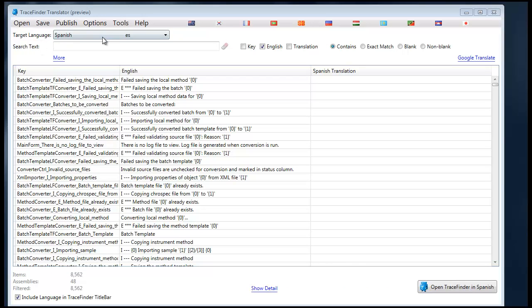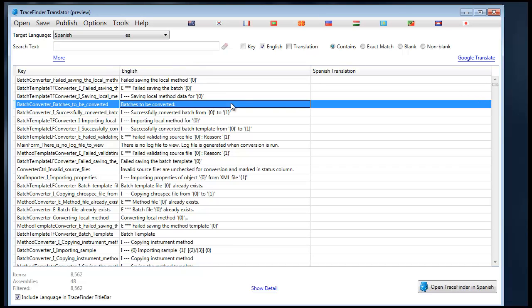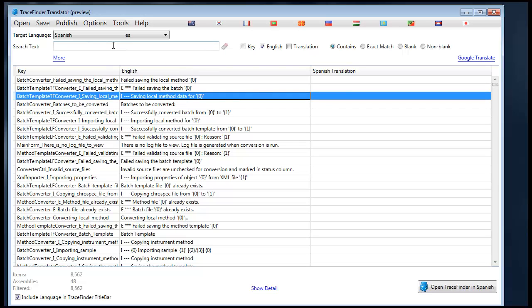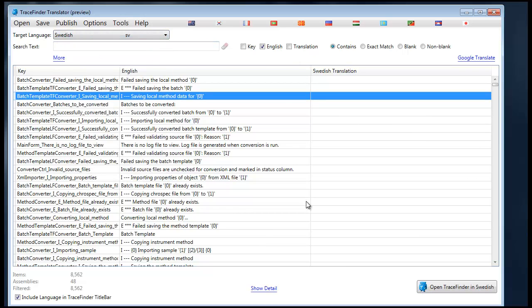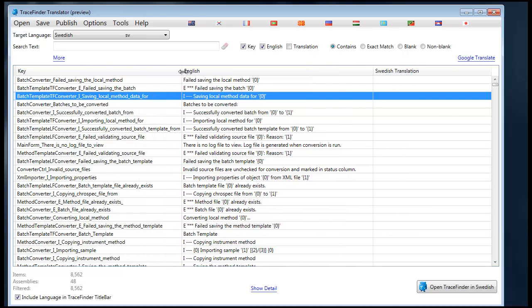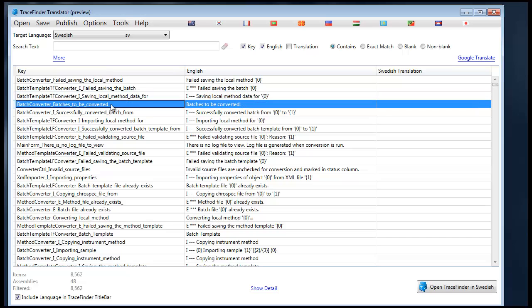Now let's jump down into the utilities for searching particular resources so that you can translate what you're looking for. You'll notice at the top here you have your locale selector. If you change your locale, it will clear all the translations, if there are any. And you can search in the key, which is the resource key — that's the key that the application uses to look up and display text on the screen.